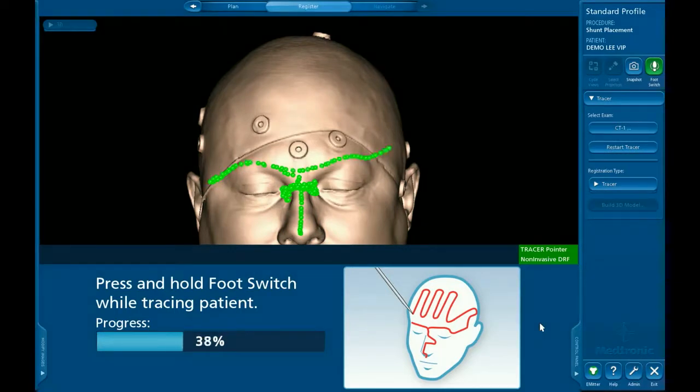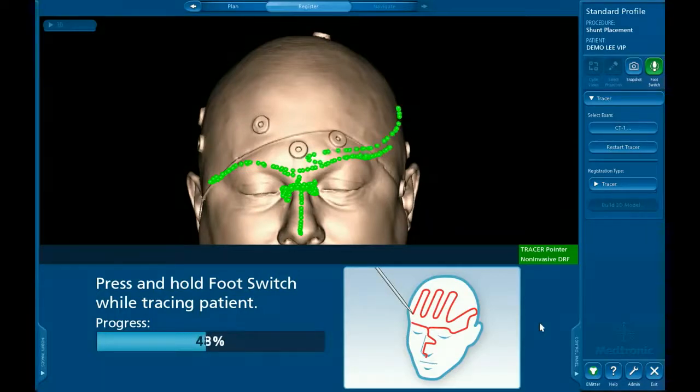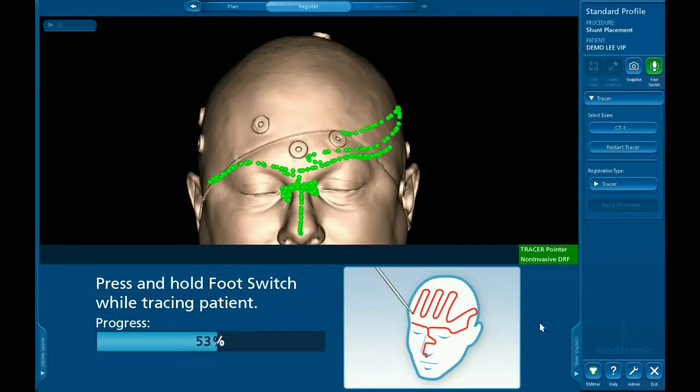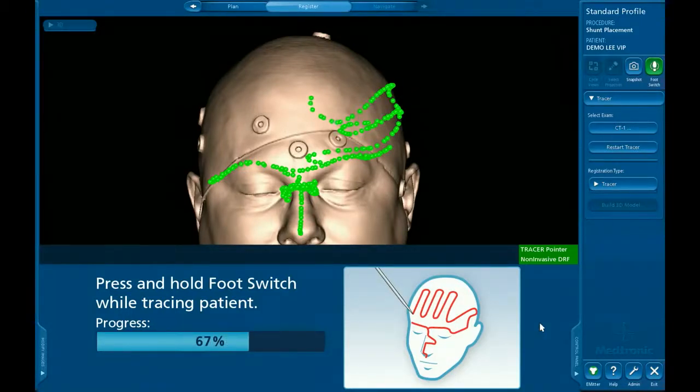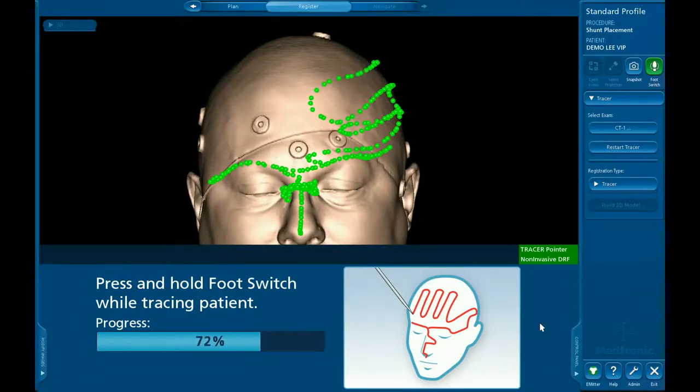the user has more flexibility in gathering points than other similar registration options and does not require trimming the hair in order to place fiducials. With all registration techniques, it is very important to gather points in a consistent manner. Pressure is important in all registration options.